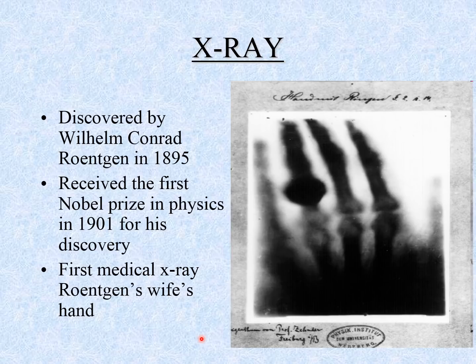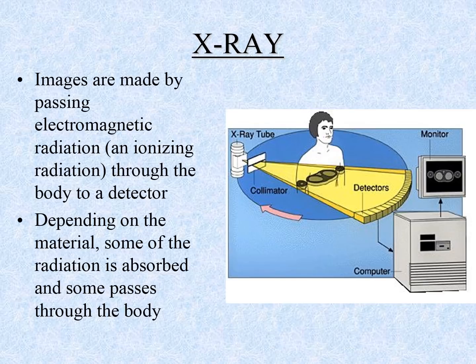Neuroimaging started based on the original identification of X-ray technology, in which William Röntgen showed that directing X-rays at the body was able to reveal some internal structure, and here's the picture of his wife's hand. A source of energy, in this case X-rays, is directed towards the body and picked up by a detector on the other side of the body. When the energy is absorbed by the body, it will not reach the detector, and the difference between what's absorbed and what's passed through the body determines what's seen in the detector.